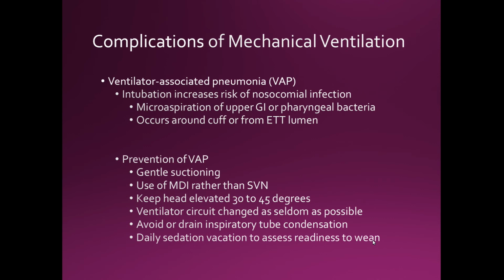That's why if we do not have a manometer, we use minimal leak technique or minimal occlusion volume, MOV or MLT. All right, so we have to have a little bit of airway or a little bit of deflation so that we are not going to occlude the airway to the point where we cut off circulation through the pilot balloon. So since I have a little bit of an opening and I have secretions that are full of bacteria, they kind of bypass the balloon and they leak down into the lungs. That's how we get our ventilator-associated pneumonia.